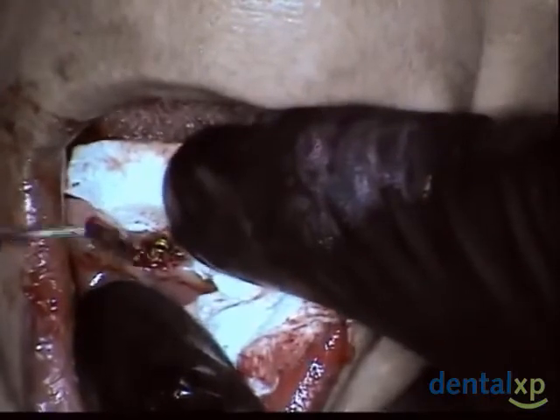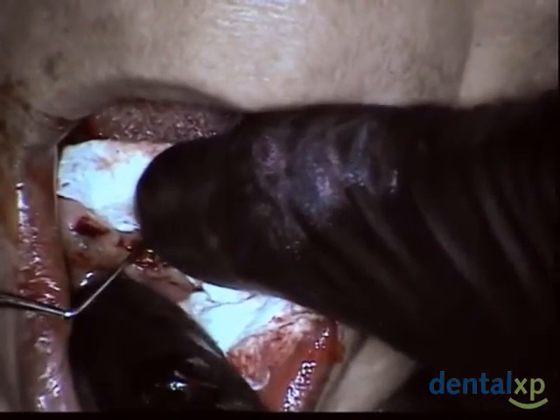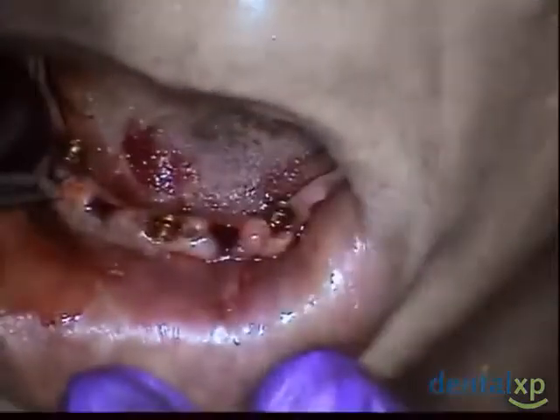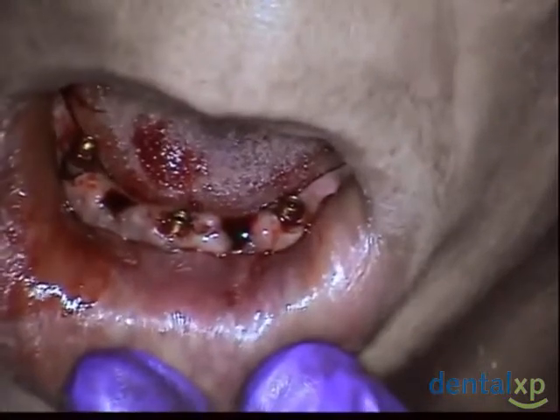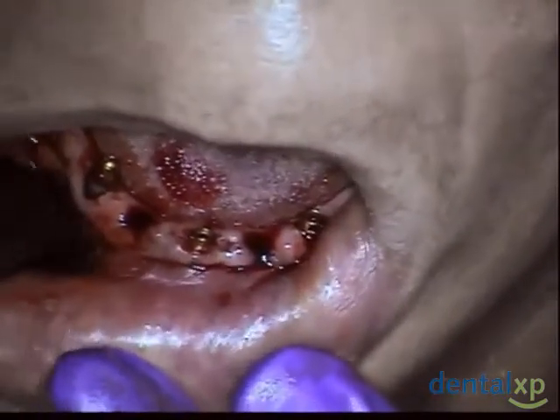And our tissue is now no longer under the abutment, which is almost seated, but yet the tissue is now coming over the facial surfaces, which is what we want. I try to make sure as I'm going to place that I have the tissue facial to the abutment as it's going down. Now we're going to go with our 2.2s, not completely seat them, but we're getting them in position.